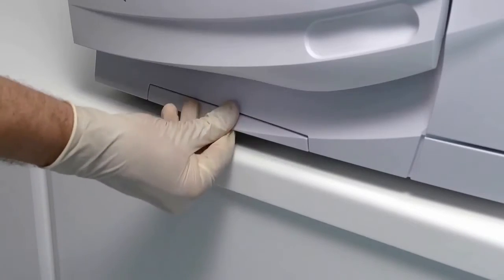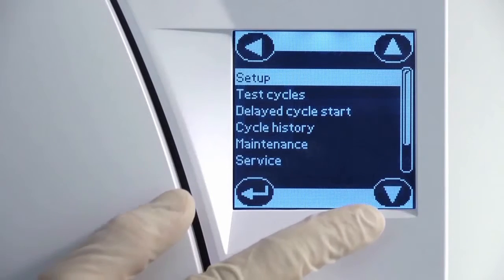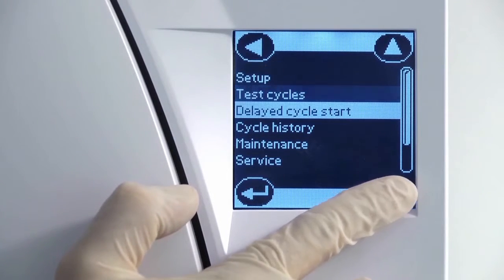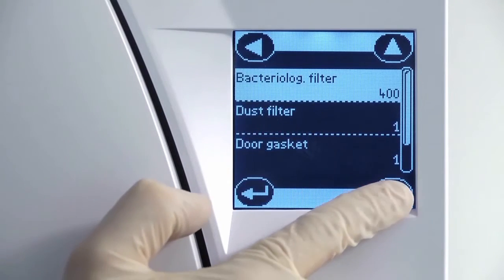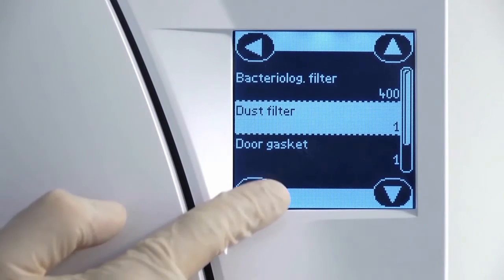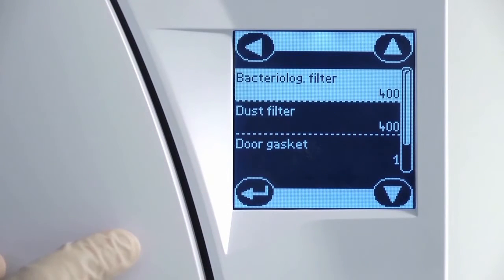Once a new filter has been fitted, navigate to the maintenance screen within the menu. From here, you can perform a manual reset of the dust filter counter. Resetting the counter will ensure that the maintenance reminder automatically reappears after another 400 cycles have been completed.